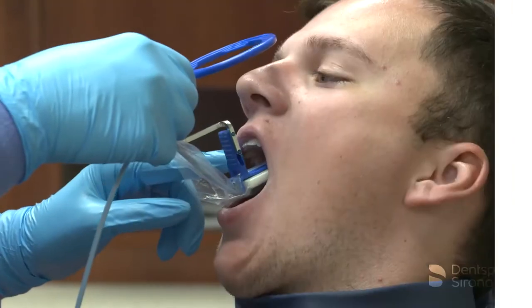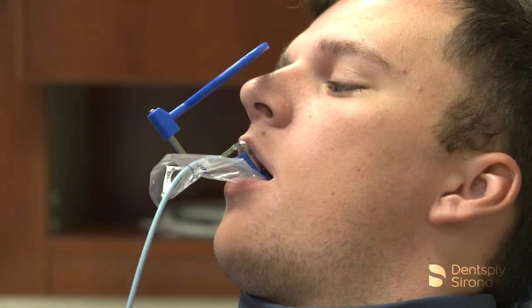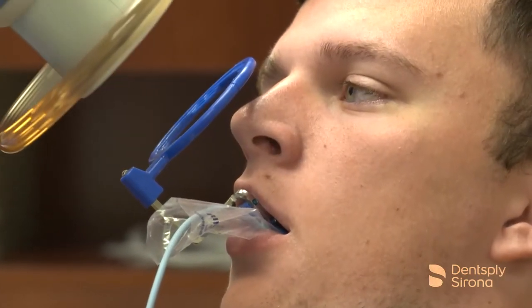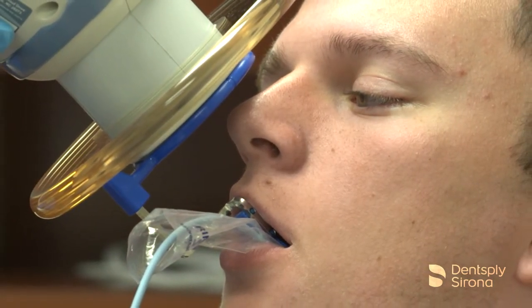To capture maxillary images using the XCP short arm aiming device, center the bite block behind the maxillary anterior teeth being captured and rest the bite block on the incisal edges. Instruct the patient to close slowly and align the handheld portable x-ray device to the aiming ring. The image is now ready to be captured.